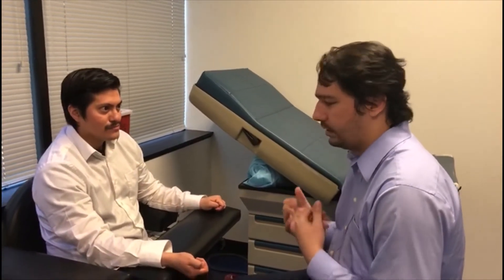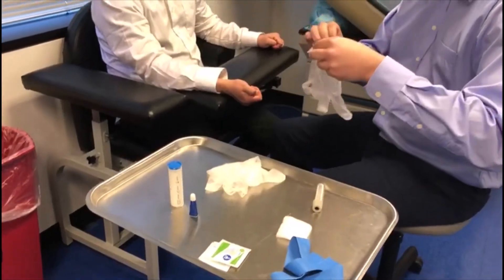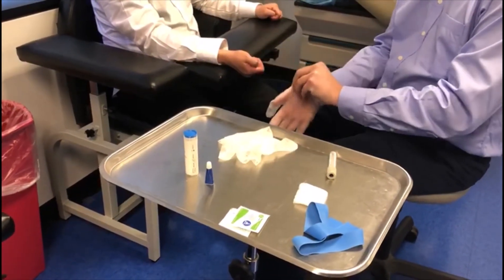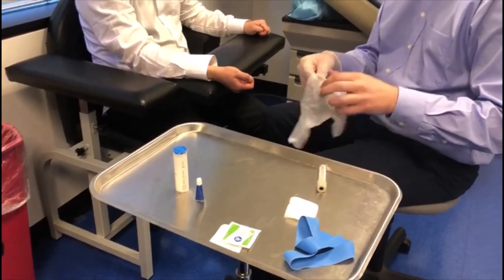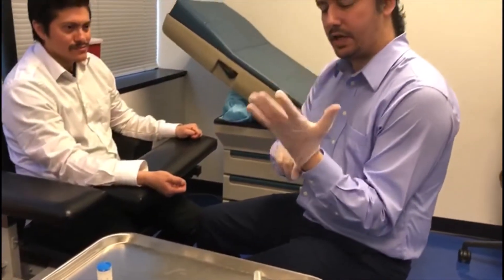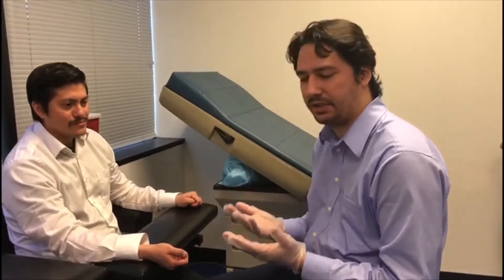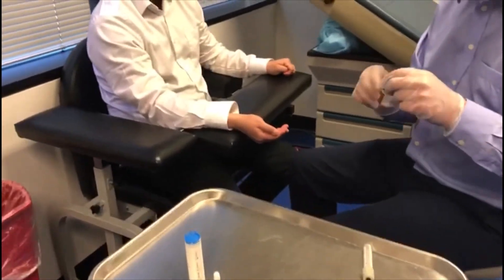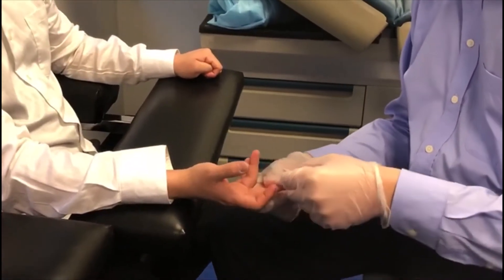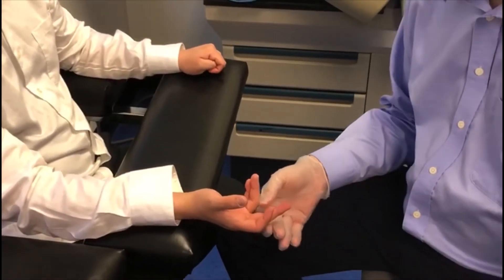Now we're going to put on our gloves. The gloves are not just for my safety — I don't know what he may or may not have — but for his safety as well, to prevent any contamination from my fingers. We're going to clean the site, and ideally you would use the middle or ring finger. I prefer the middle finger, so we're just going to clean the area. As it is drying we are going to set up our equipment.